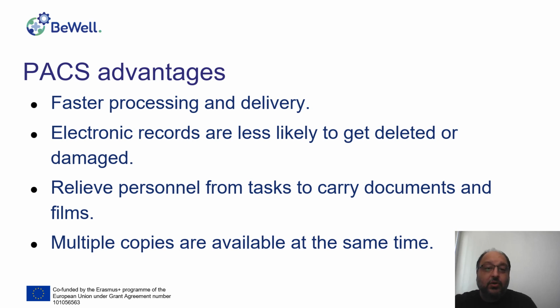And imagine the radiologist prepares the report, then sends the report, and the referring physician looks at the report, looks at the images, but needs to consult the radiologist, and this happens 2 or 3 days or even 1 week after the radiologist prepared the report. Of course, the radiologist may not remember what happened, and in this case, both the referring physician and the radiologist, and maybe even some other physicians may look at the same images at the same time, not being at the same place, maybe each of them at their office, and look at exactly the same image.